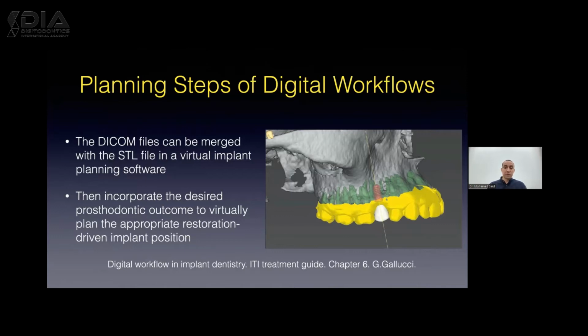After we plan for our restoration, we can virtually plan the appropriate restoration-driven implant position. So we plan for the restoration first, and depending on our restoration, we do our restoration-driven implant position. We plan for the implant position depending on our restoration position.